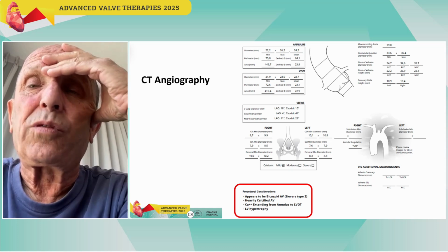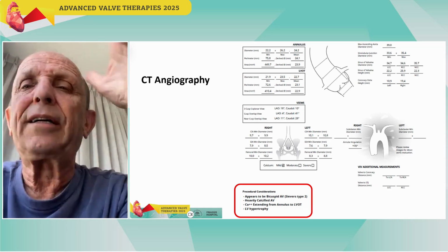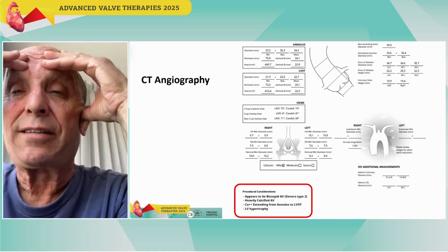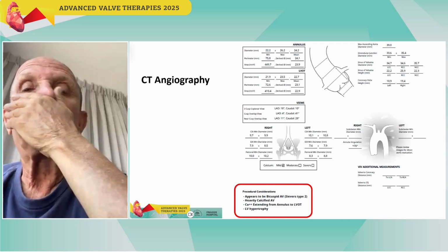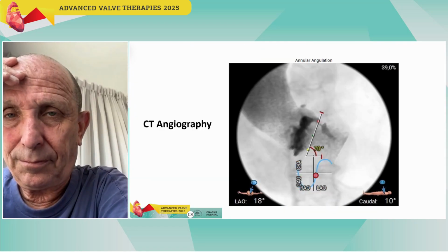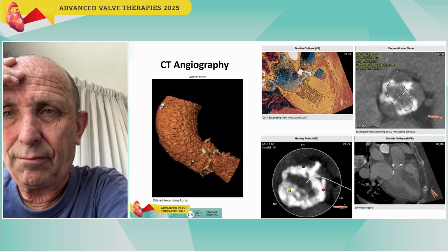And I think it would allow the self-expandable Evolut, with the radial force, to expand much nicer. One more slide after, to show the follow-up. Yeah, it's still a little bit before. Yeah, this one. So this is exactly the annulus, the perpendicular plane.